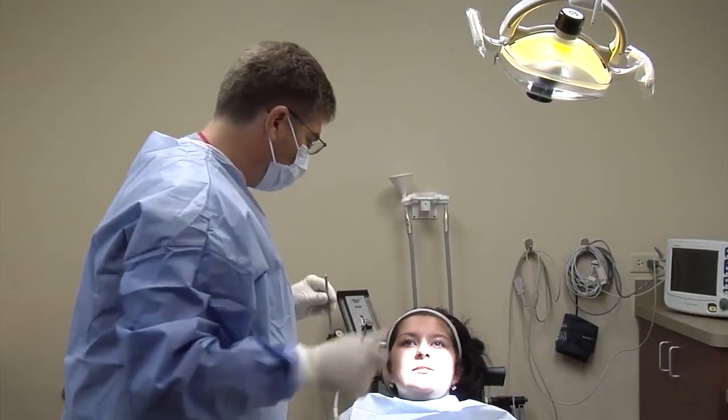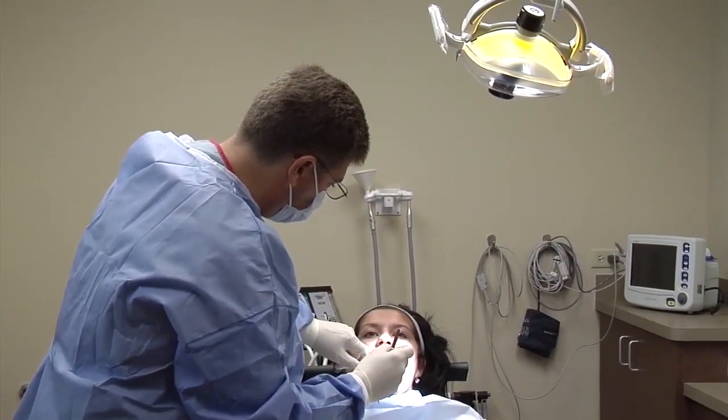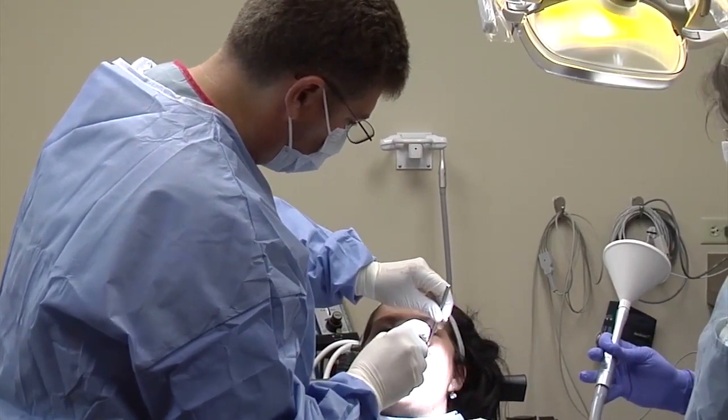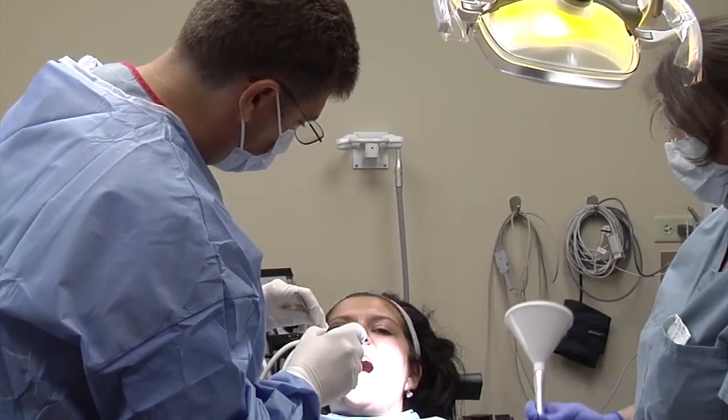As they told me what was going to happen and how they were going to do it, I was much more comfortable. The surgery is done in the oral and maxillofacial surgery office using local anesthesia. The TAD is simply screwed into the proper position and the patient can resume their normal activities that day. Patients generally do very well after this surgery and any discomfort can be handled with an over-the-counter pain medication.